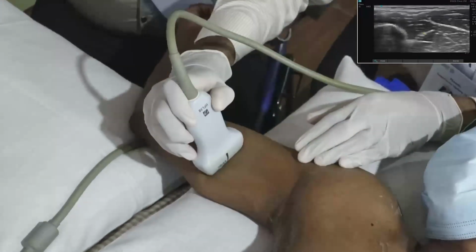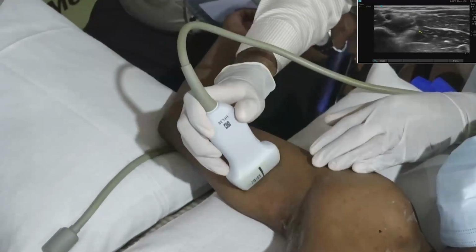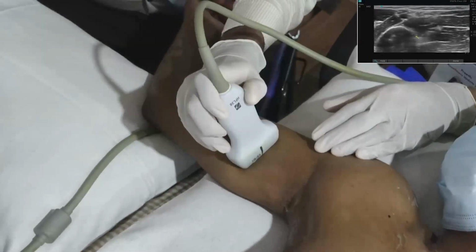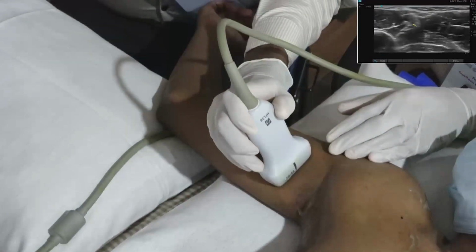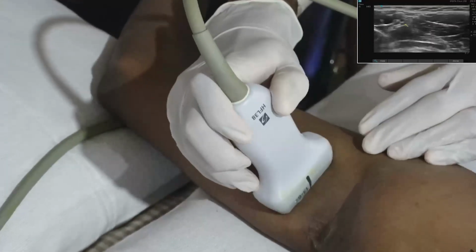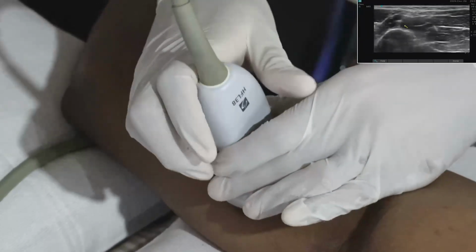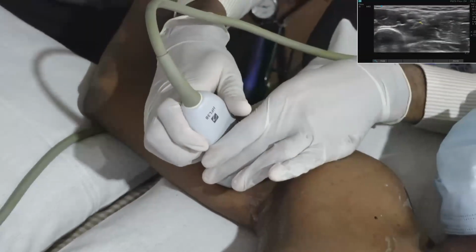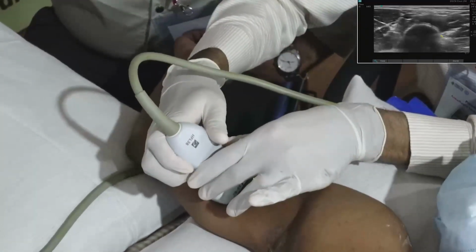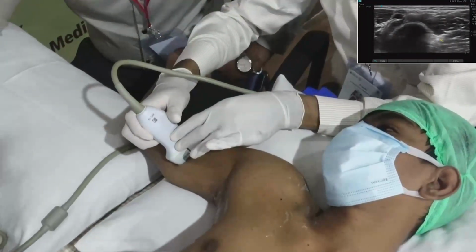If you scan distally next to the radial groove, one nerve component is seen, which slowly, they say, falls over the humerus. If you trace it back, it occupies almost a 6 o'clock position. Now we are seeing the radial nerve coming and entering the radial groove in the humerus.